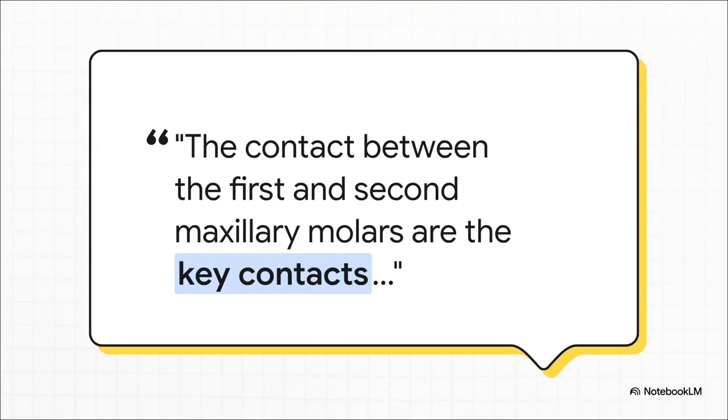And this quote right here just brilliantly shows the skill involved. Sometimes, because of a person's unique anatomy, getting a perfect shot of everything just isn't possible. So what did they do? Well, professionals have a priority list. This tells us they will always prioritize getting that space between the big upper molars open, because that's such a critical area for cavities. It is all about real-time diagnostic problem solving.